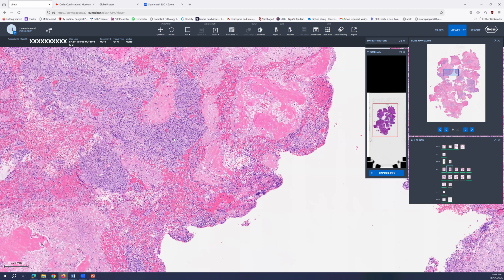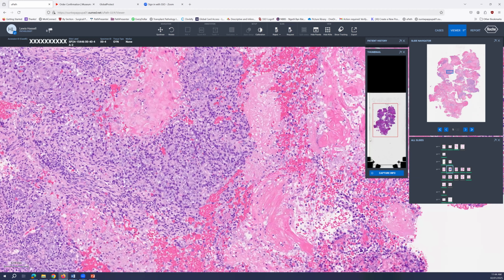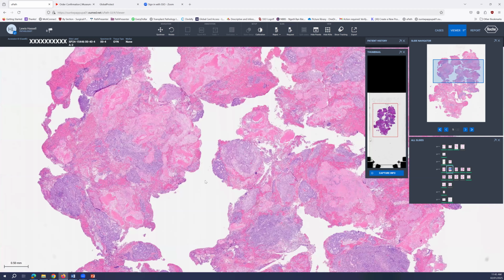And this, along with the very diffuse high-grade malignant neoplasm, which you can see here, some of these very high-grade cells almost immediately adjacent to areas of the keratinization. Now, whether that inflammatory response has any role in the progression of dedifferentiation is interesting and uncertain at this stage. But certainly in this particular case it presents as an almost dominant feature to have all of this keratinizing material in the curettage sample.